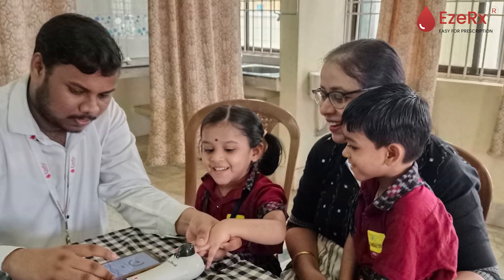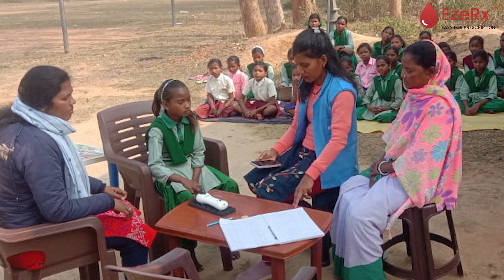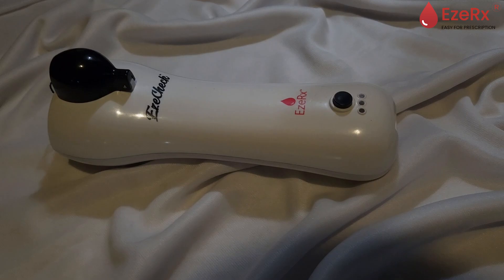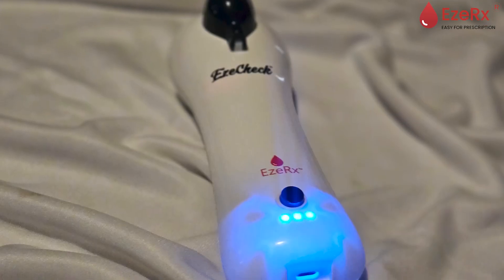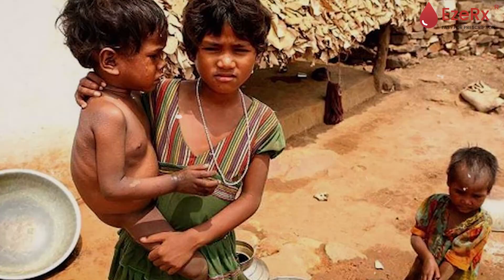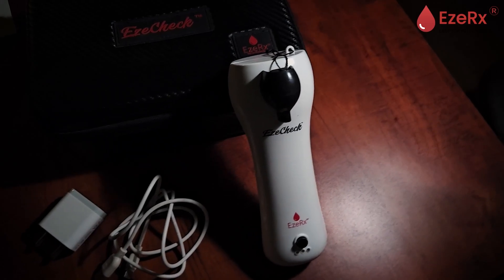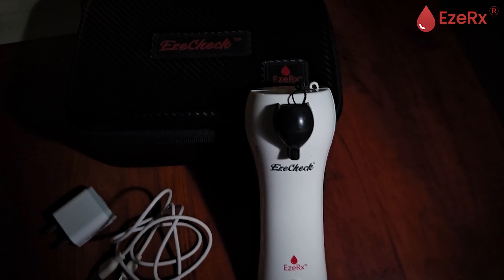From hospitals to schools and community health programs, EzeCheck is reaching those who need it most. EzeCheck is more than a device — it's the future of anemia screening, helping to detect and manage anemia early and improving millions of lives around the world. Join the revolution in healthcare and make a difference with EzeCheck.